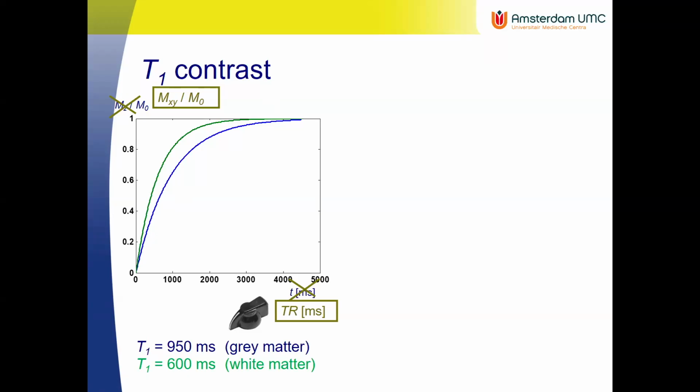Actually, would it be useful at all to wait this long? But what is the contrast? If we're not getting T1 contrast, what is the contrast that we're getting? Does anyone know? If you think of that very, very first basic slide. Proton density, yeah. So it's always there.